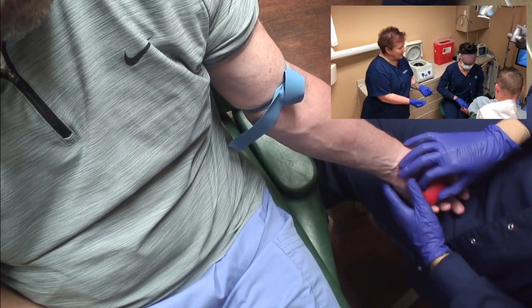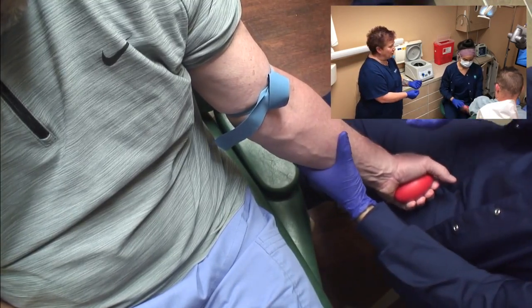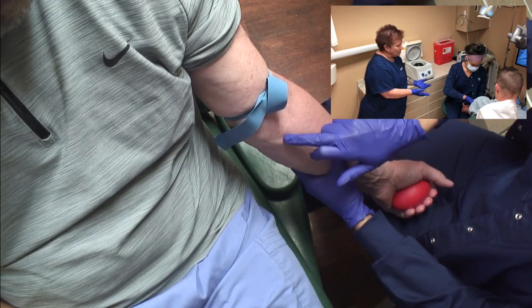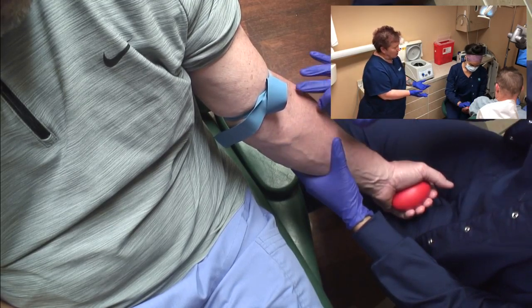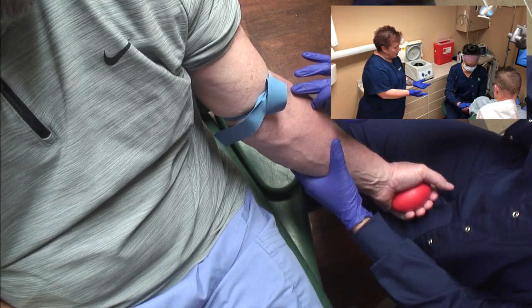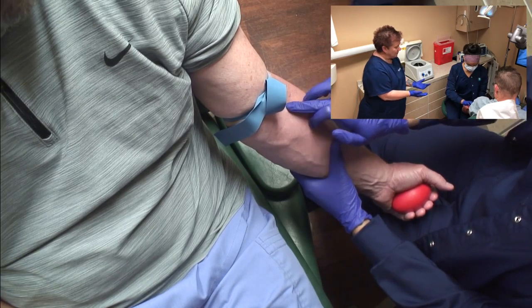Now, not everybody is like Dr. Heller, and you can throw a dart from out in the hall and find a good vein. He's got several good choices here. That one right there is kind of rolly, so that's not going to be China's choice. And she's looking. And I think she's found her vein.